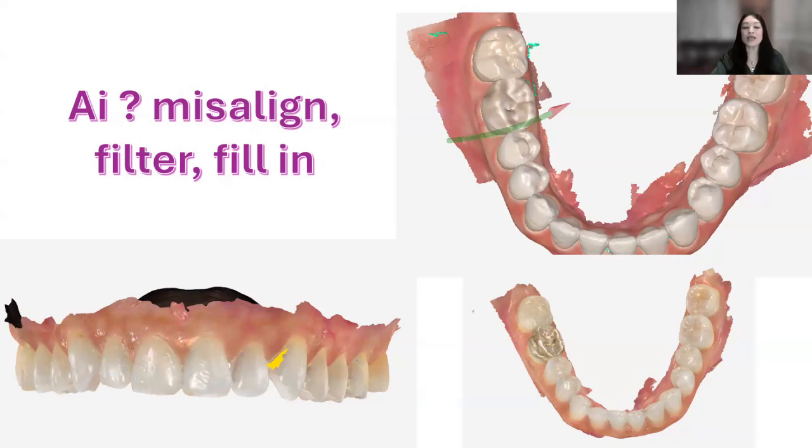The bottom picture that I show you, there's really nothing to show. Why? Because I'm going to show you it in a video. AI has the ability to filter when it sees something that was not a clean scan, but as you slowly hover over, it'll rescan it and clean it up for you. So that's another thing to think about.